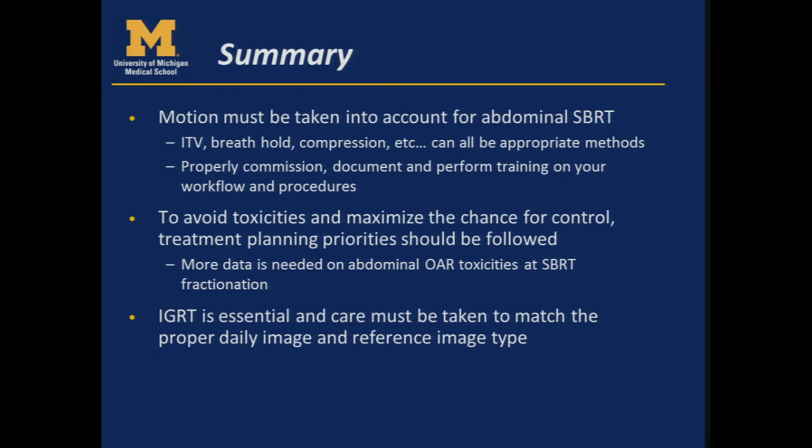On the physics side, we know that we have to take into account motion for abdominal SBRT. There are lots of different ways to do this, but you want to make sure you have your system properly commissioned and your staff trained. You want to avoid toxicities and maximize your ability to control the tumor. You want to follow strict treatment planning priorities, and we really need to get more data on abdominal OAR toxicities because that's one of our limiting factors in dose escalation.